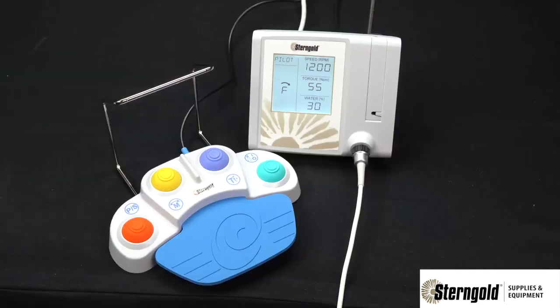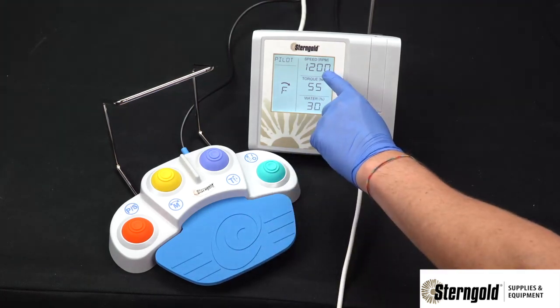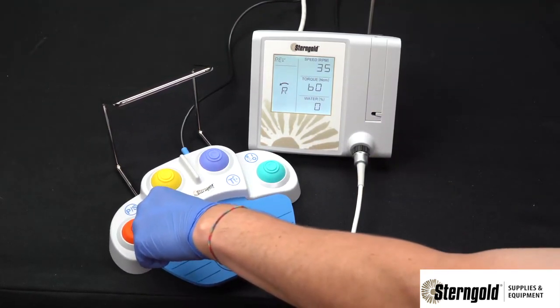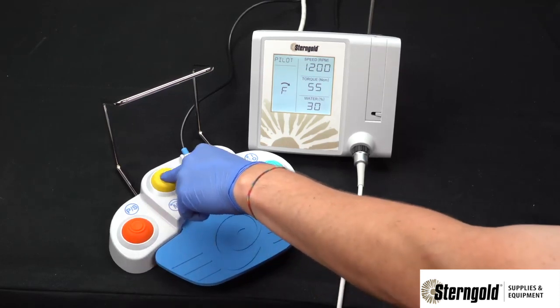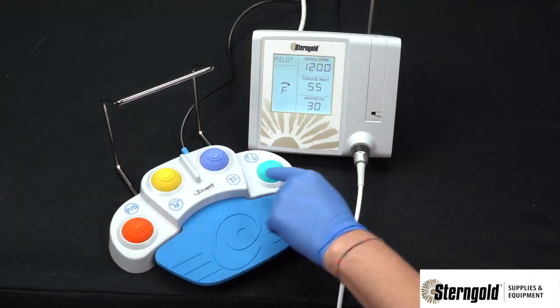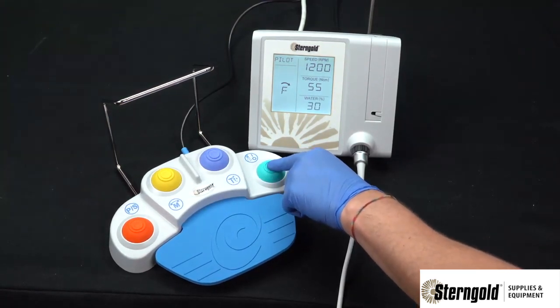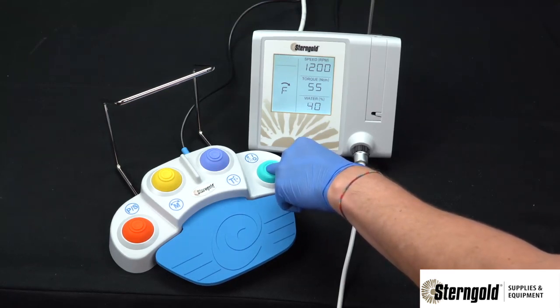The included multifunction foot pedal replaces the need to adjust the unit manually during a procedure. The blue pedal is variable speed control between zero and the set speed on the display. The orange button cycles through the memory positions. The yellow button switches between forward and reverse. The green button turns the irrigation pump on and off, and when pressed and held, it cycles through the irrigation levels.